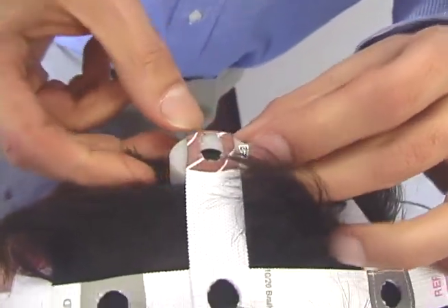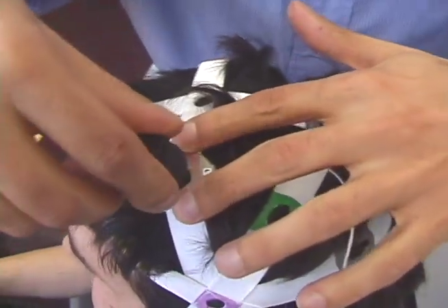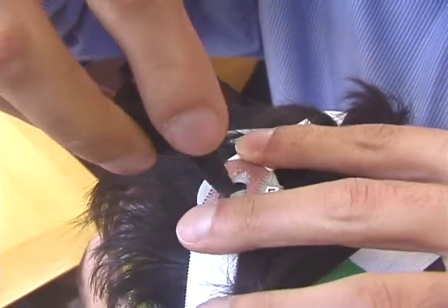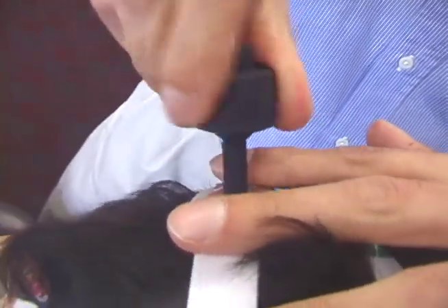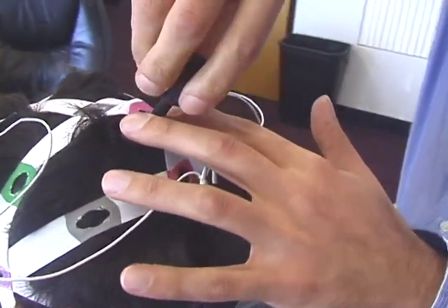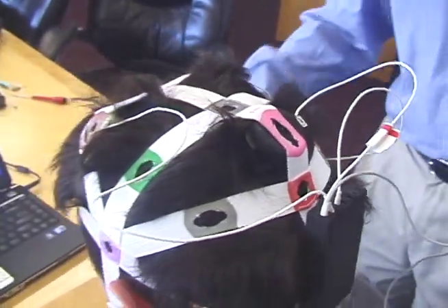Once all the sensors are in place, you can manipulate electrode tips through the hair using the supplied tool. To do so, hold the sensor down with two fingers around the hole, then insert the end of the tool through the hole on the top of the sensor and rotate back and forth a few times depending on hair thickness and sensor location. Ensure that the electrode tip is flush against the scalp, then remove the tool before removing the supporting fingers.